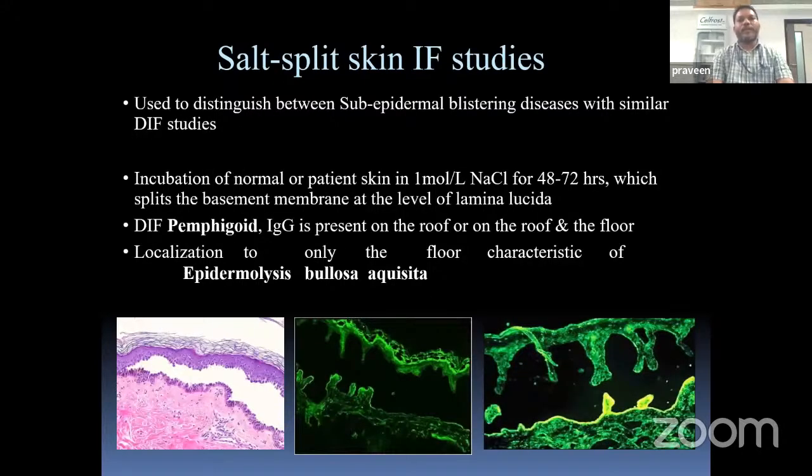The salt split technique performed on skin biopsy for skin IF is used to distinguish between subepidermal blistering diseases with a similar direct immunofluorescence study.